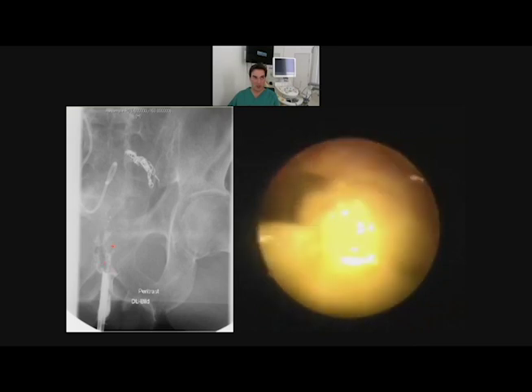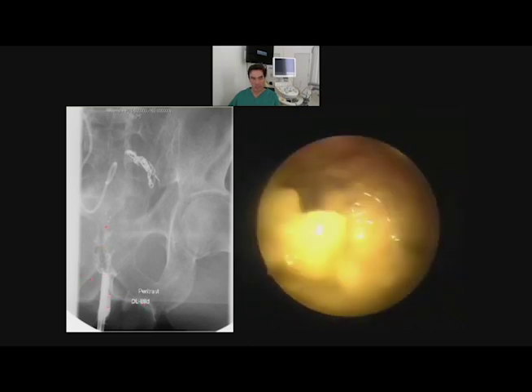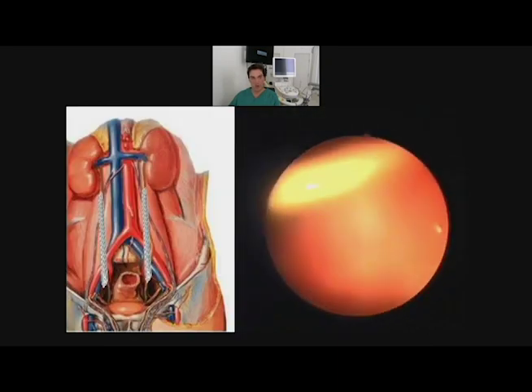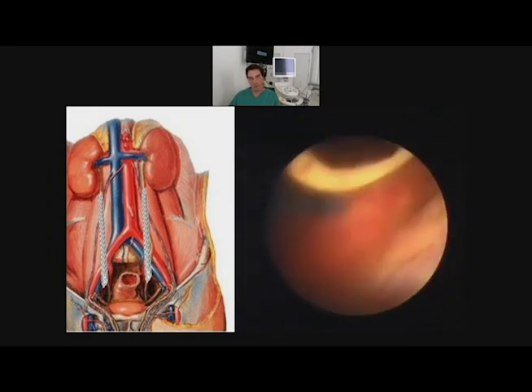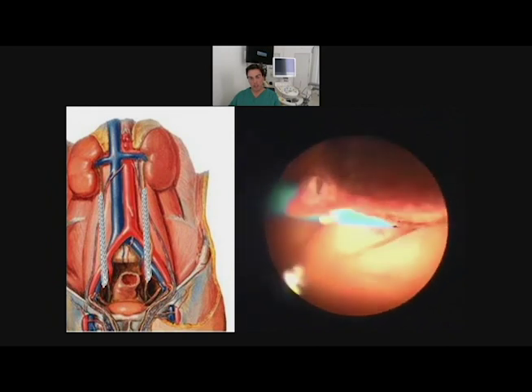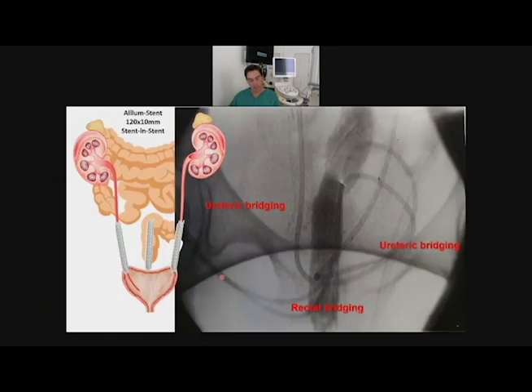We check it also from the rectum. Here was the part, I go with the scope inside the rectum and we see all is dry because the stent is working very well and no fluid is coming to the sacrum, all is okay. Next case, same problem. We put now two stents on both sides. You see here the macrohematuria. It was also a problem of ureteral arterial fistula. And in these cases, we need only two stents and all is okay.